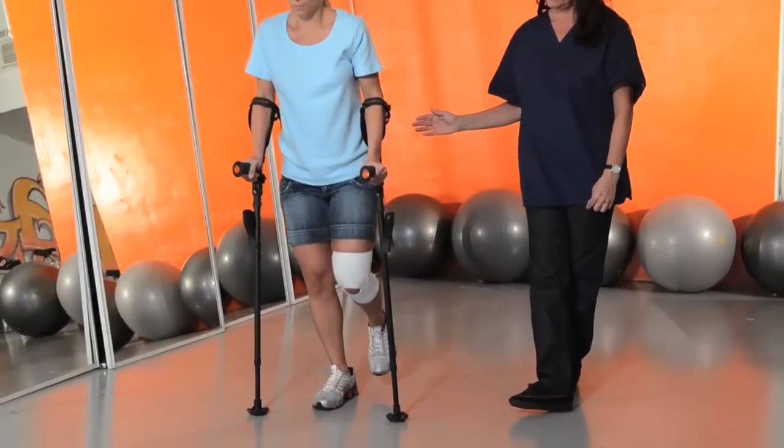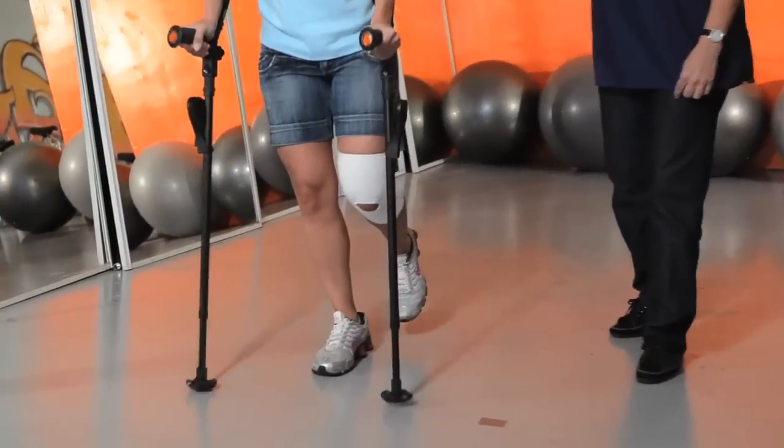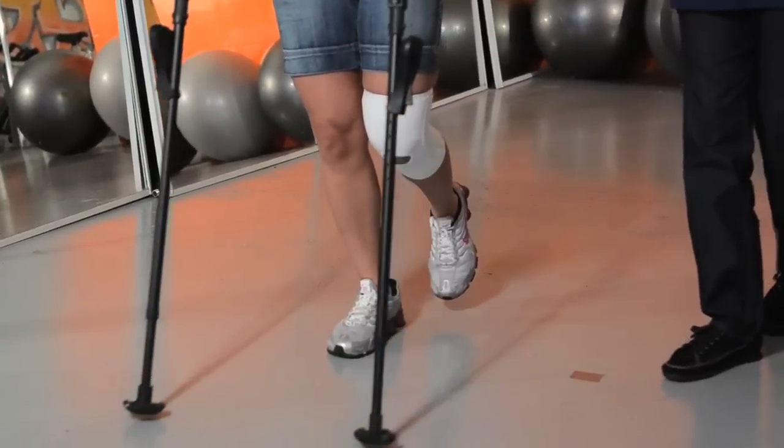Remember, the purpose of the crutches is for the user to offload weight away from the affected extremity to the crutches while he or she walks.